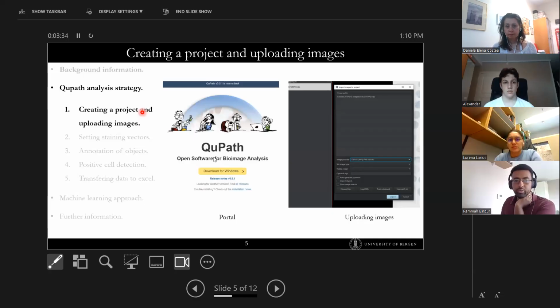Okay, what can you see right now? Is it my PowerPoint slides or is it QuPath? PowerPoint. It's still your PowerPoint, yeah. It's still the PowerPoint. Oh, okay. Yeah, one second. But we could see it with your notes. Yeah, let me share.